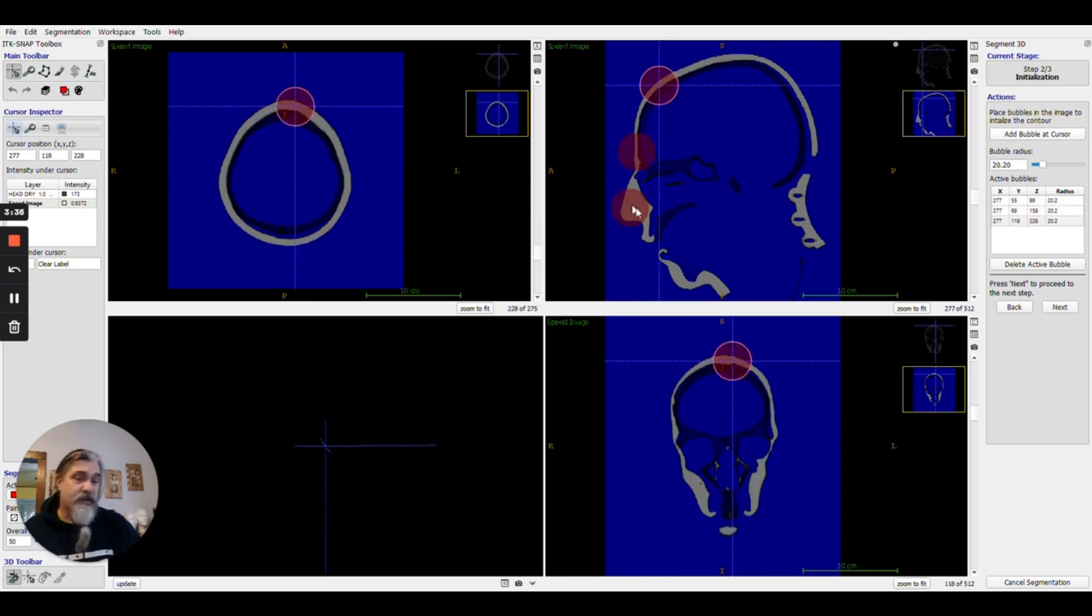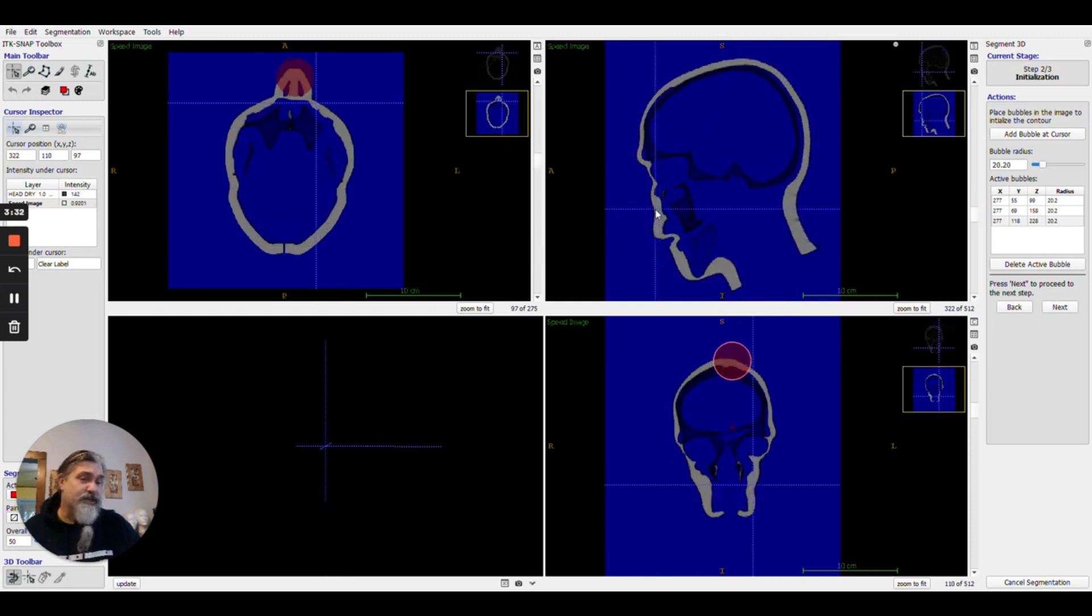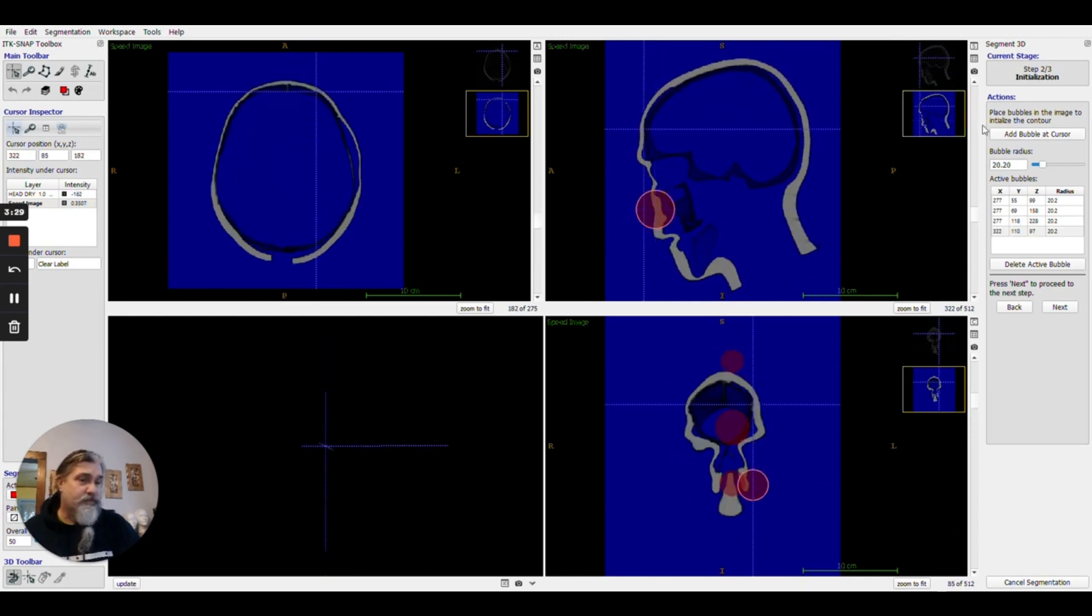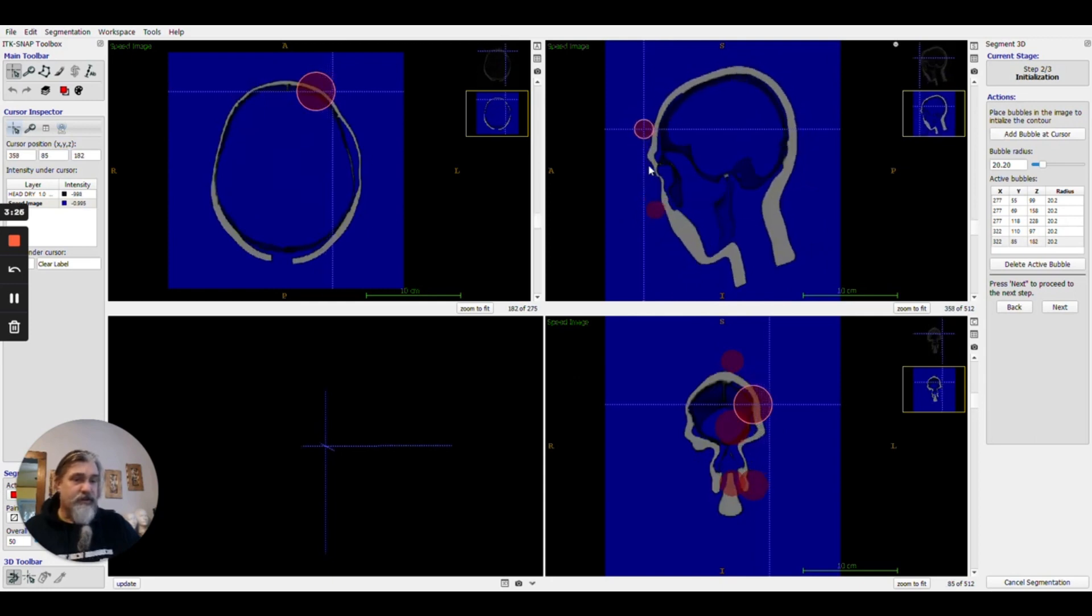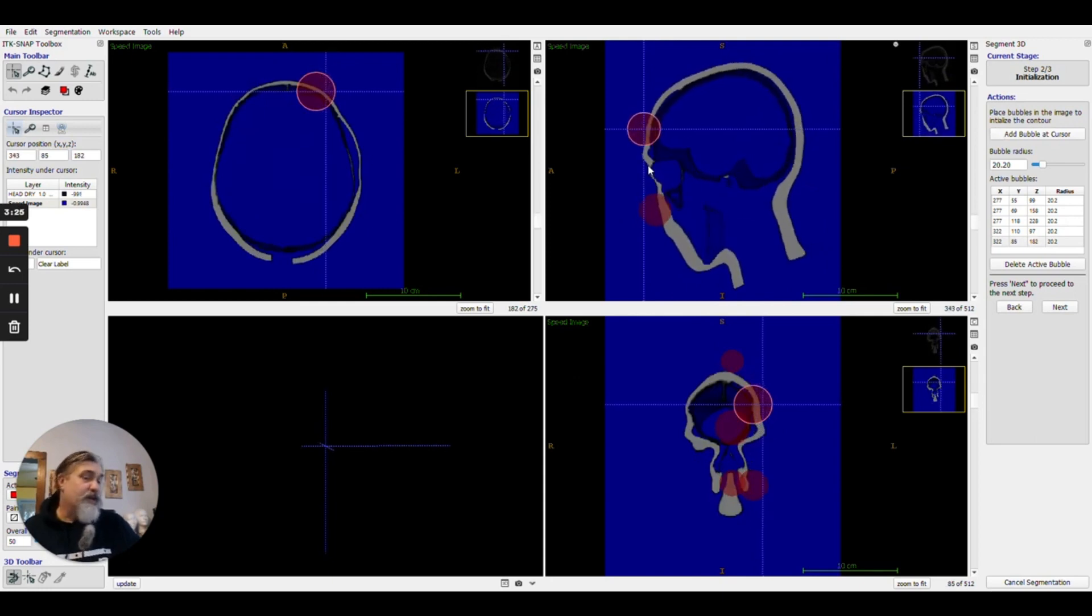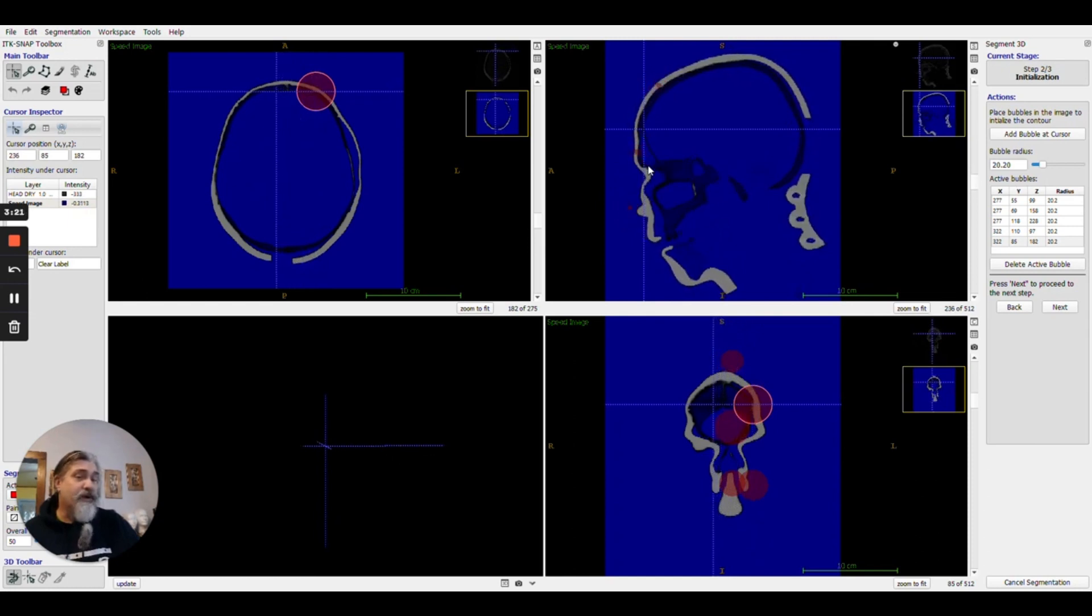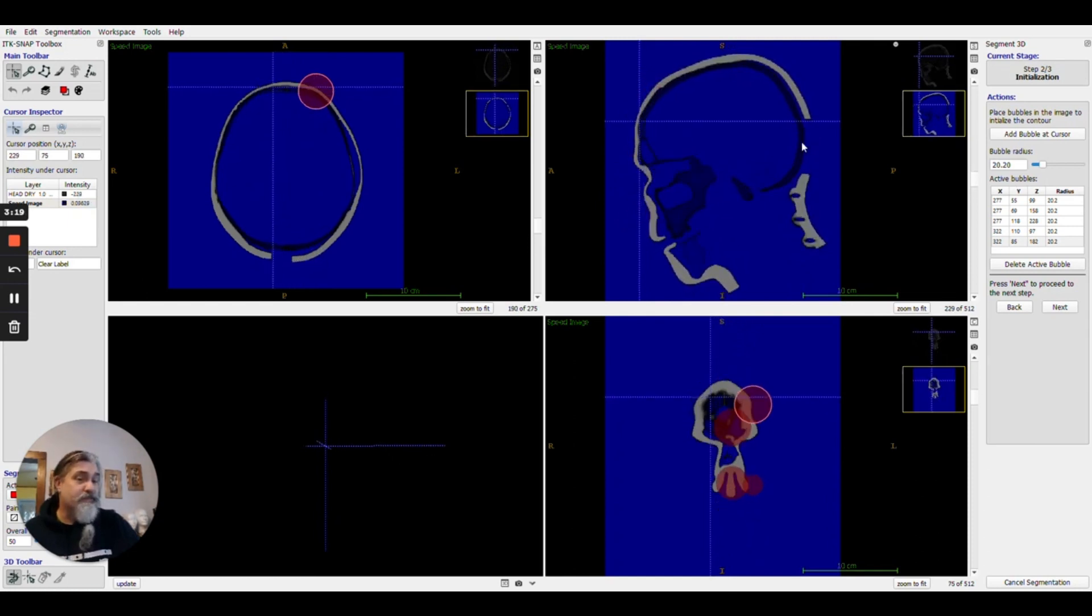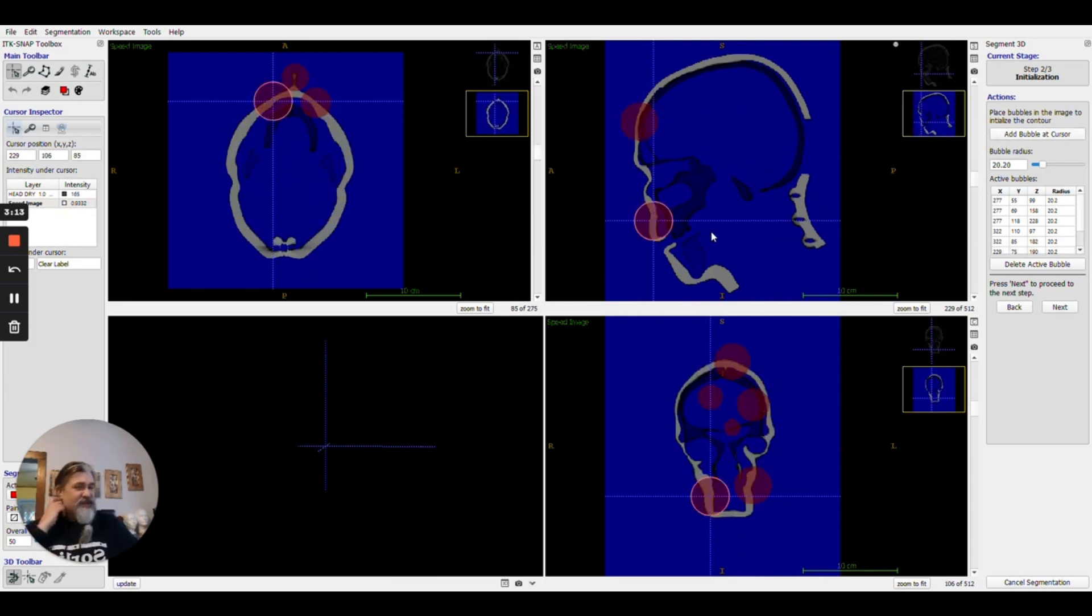I'm going to scroll through and maybe get a few other spots. Come back the other way, get a few more just to kind of get better coverage of part of this guy's face. Once I feel like I've got things covered relatively well, I will go ahead and push the next button.